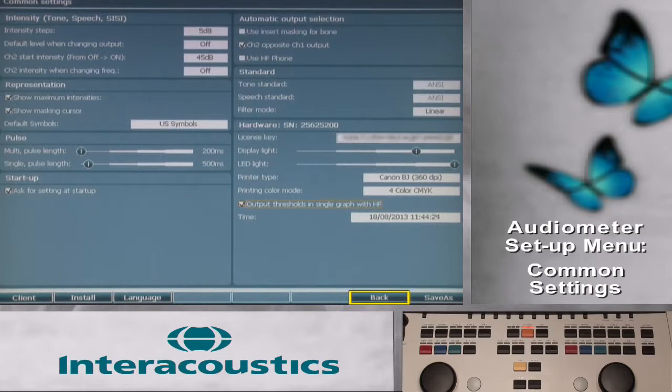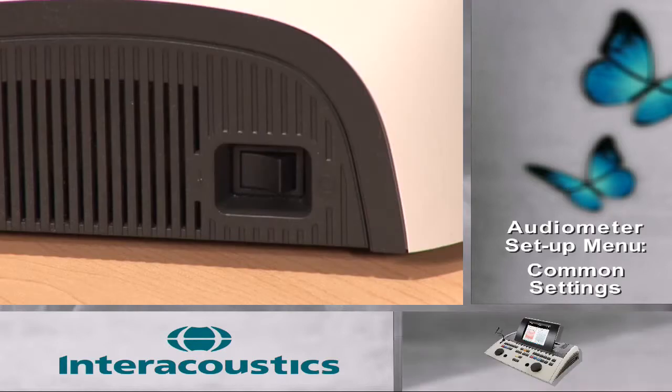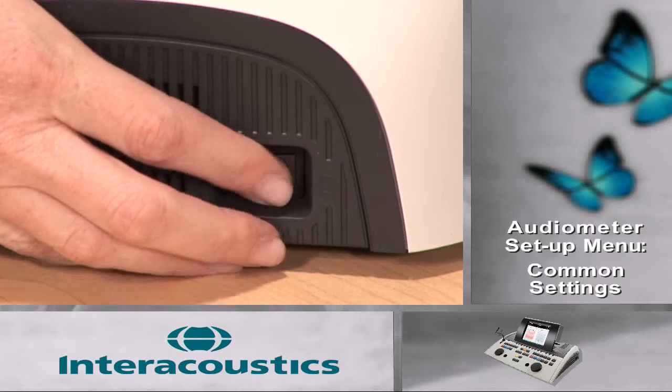Back moves you out of this screen to return to the testing function of the audiometer. And lastly, Save As allows you to save any changes made to the setup screen. When the protocol is saved, the examiner can save within a current user setting or create a new user setting. When making changes to a setup screen, shut off the device and turn it back on for changes to take place.